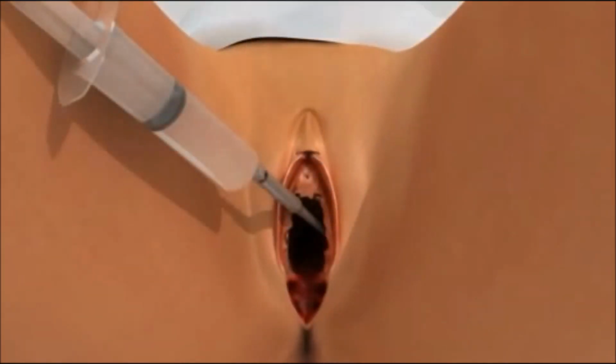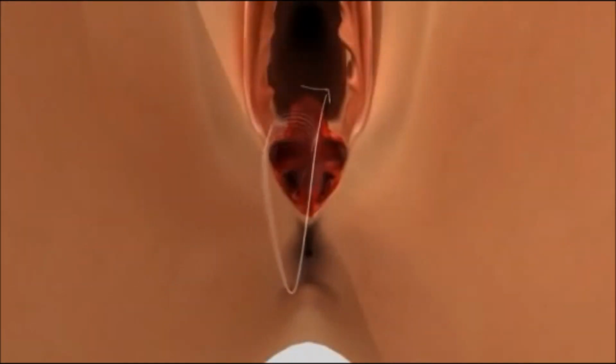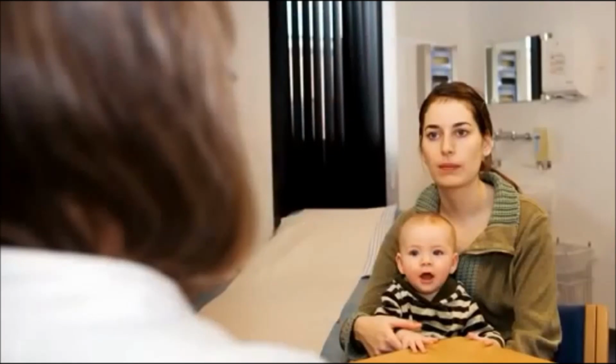You can learn about effective methods of applying local infiltration or a pudendal block. We will demonstrate two different suture techniques. This animation will show you the continuous method in accordance with evidence-based guidelines from the Royal College of Obstetrics and Gynecology. Suturing, using a mixed suturing technique which may be relevant in the case of complex lacerations. There is a follow-up section about the healing, recovery, and treatment of possible complications.